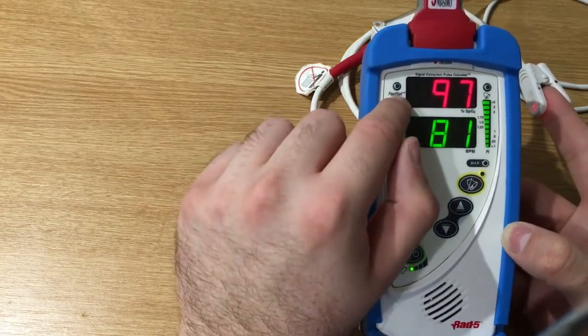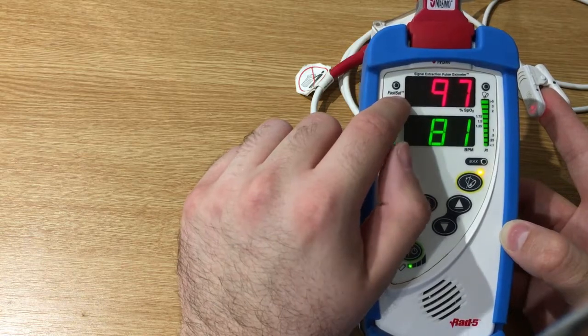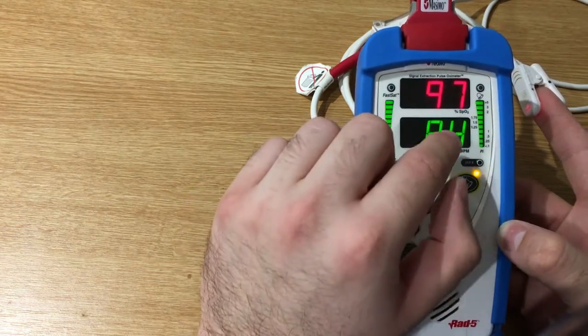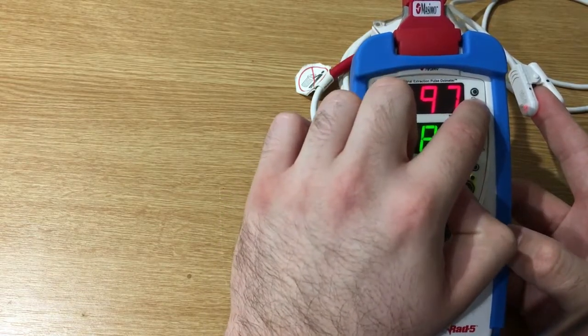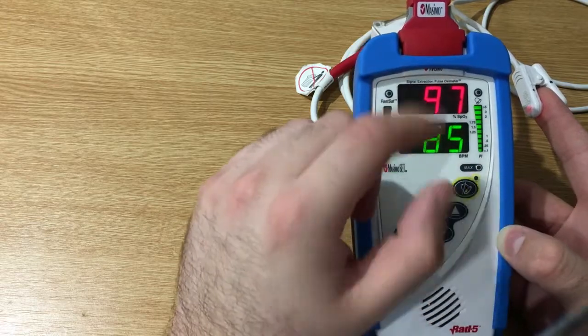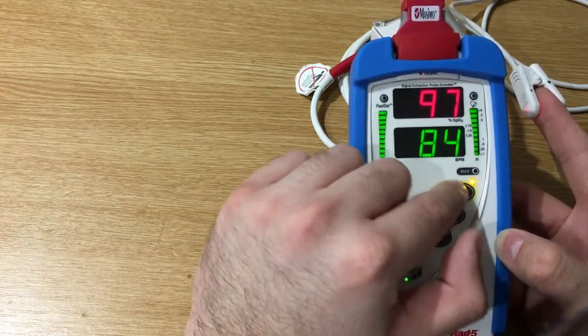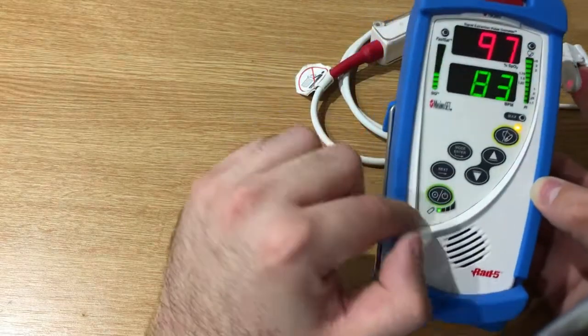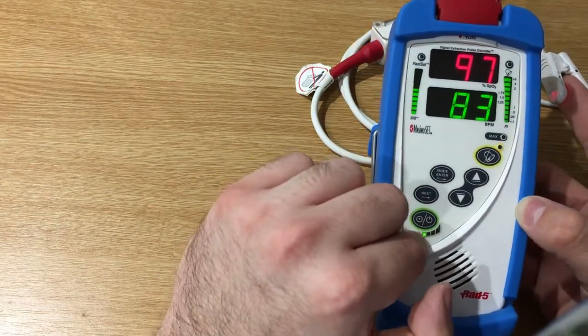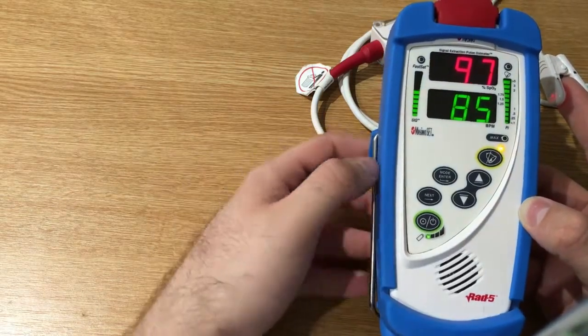As you can see here, there is the fast sat indicator. The fast sat is a feature that rapidly tracks changes in arterial oxygen saturation. Here there is the alarm LED. Here there is the silence LED, so if we press this button we'll silence the alarm, and here it's blinking because we have a low battery. And this one, as you can see, is the battery indicator.